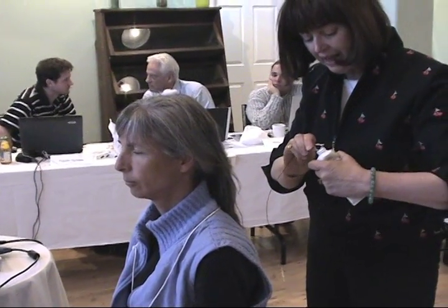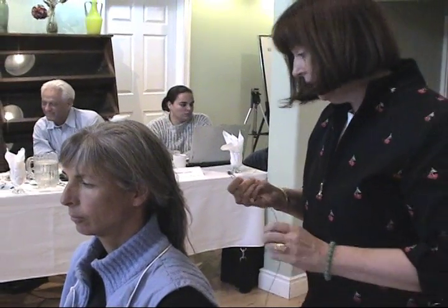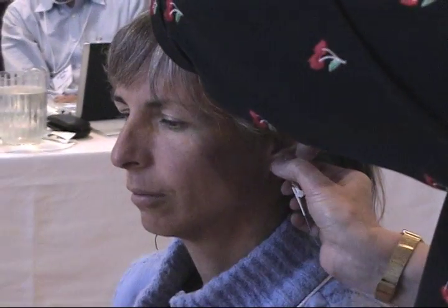Remember to completely cover the metal surface, because you don't want one part of bare metal touching the skin and another part with the gel. So there — now Sharon has new earrings on.